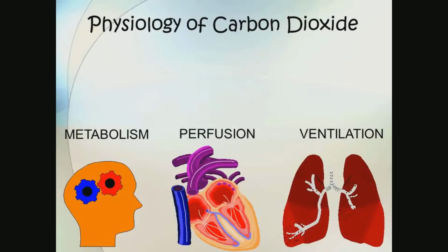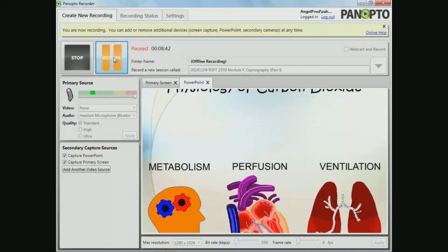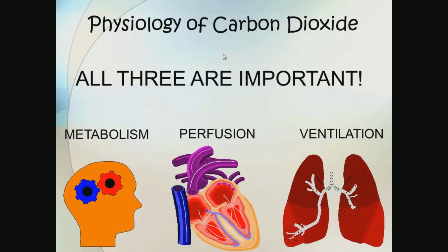Let me pause it here. Tell you a little story, my little rant. All three are important, is the bottom line. They all play into the creation of CO2 being exhaled.